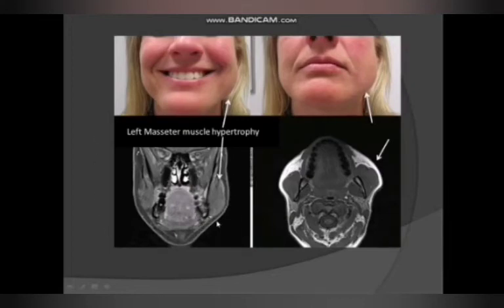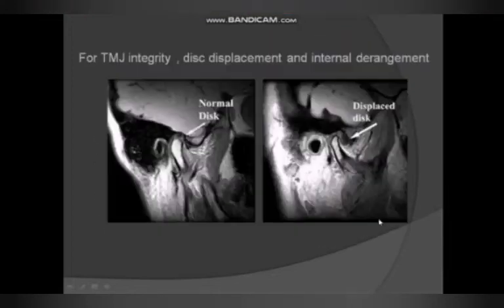Also an MRI image. Another use is for the TMJ, integrity, disc displacement, and internal derangement.